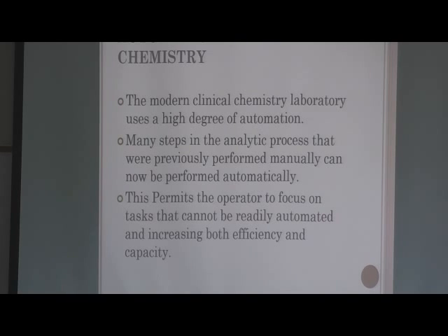That's going to be the size of that scatter around the target. Accuracy is how far the average is away from the target, right? Remember? Don't worry, I used to get those confused, and I still do all the time, unless I think about it for a second. So yeah, that's one of the reasons why they're going towards automation.